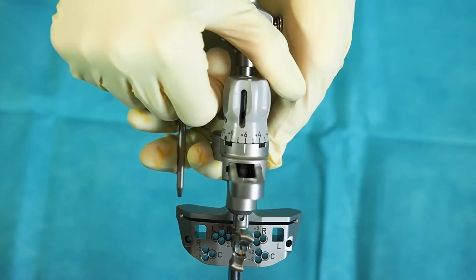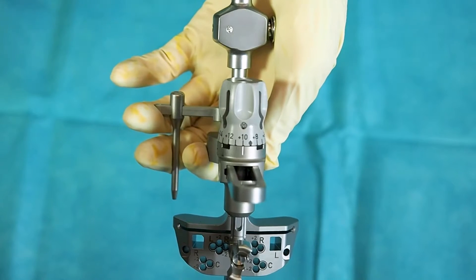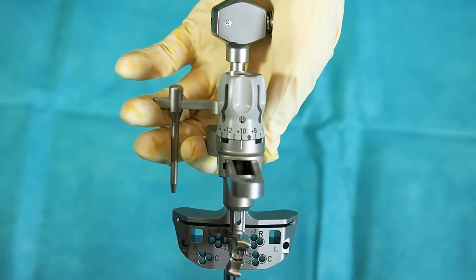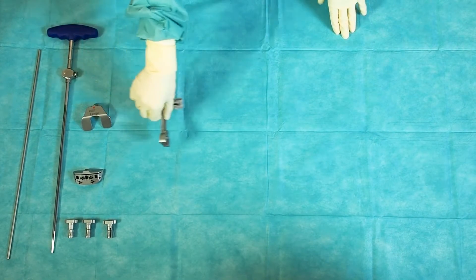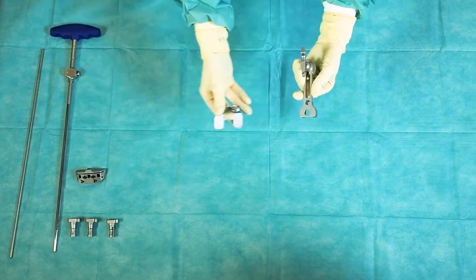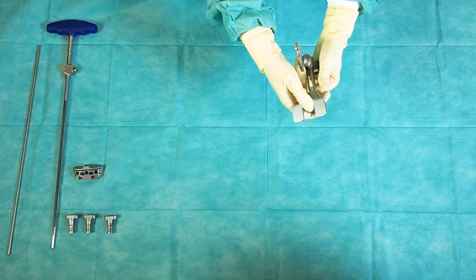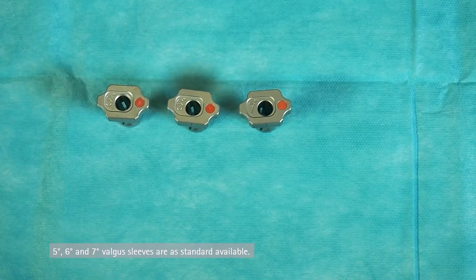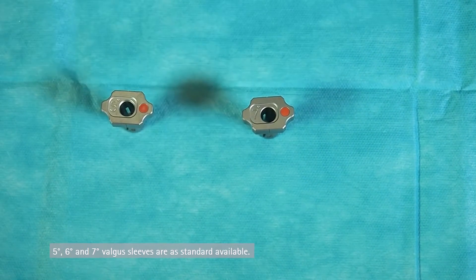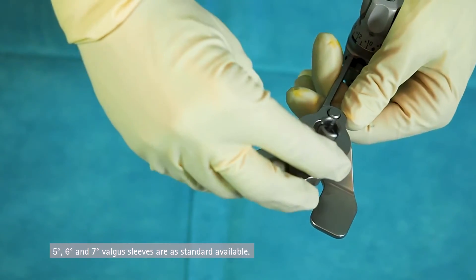The resection level is adjusted by turning the wheel. Connect the distal femur contact plate to the intramedullary alignment system. Choose the appropriate orientation sleeve in 5, 6, or 7 degrees according to the preoperative planning.